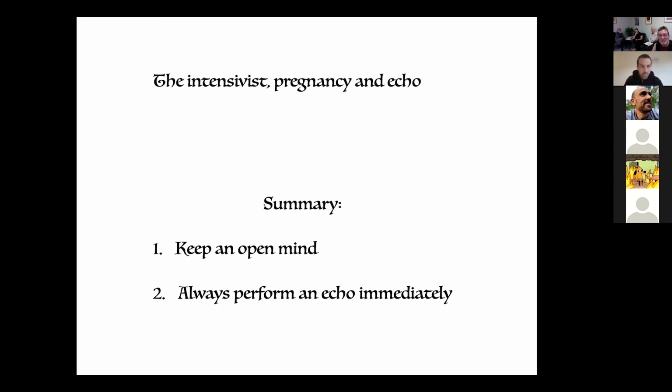So I think my last slide is, for the intensivist, pregnancy and echo is always keep an open mind. Like a couple of cases presented today, you go in looking for something and either you don't find it, or you find something completely different, and just perform an echo. Don't mess around, just get an echo done anytime, day or night, as soon as the pregnant woman with a complication, or the immediate postpartum woman, ends up in your caring hands, because in fact it gives you so much information.